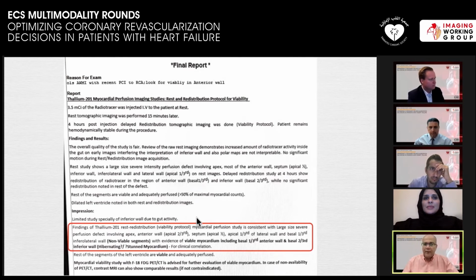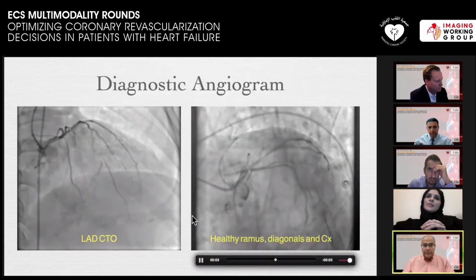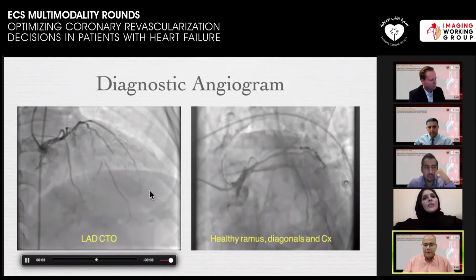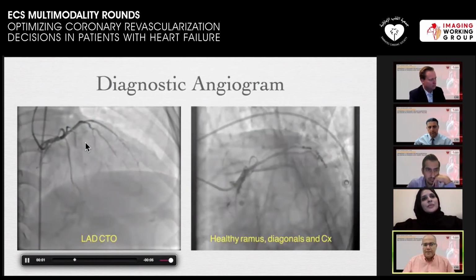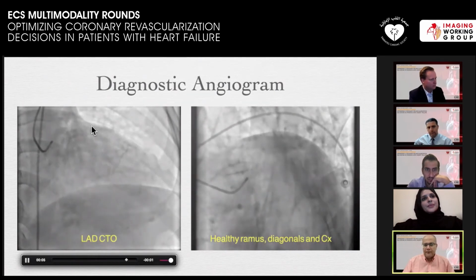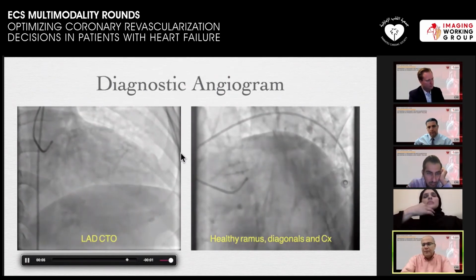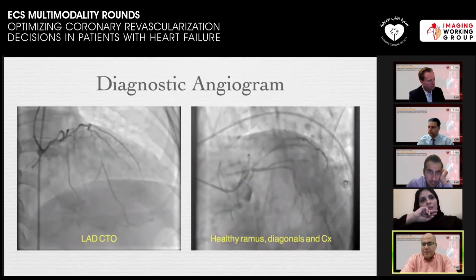And I would like to correlate that with angiography, so let's look at the angiography again. The mid and distal parts of the LAD that are non-viable based on the thallium are filling, whereas the basal part, this septal perforator is not filling. So maybe we can discuss that. What would Dr. Ronnie do for this gentleman?